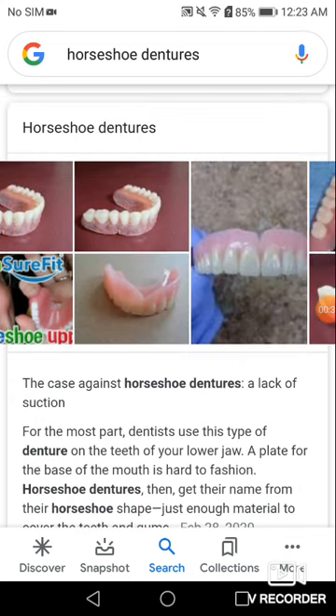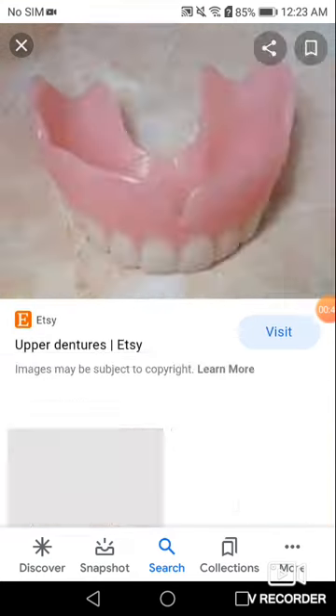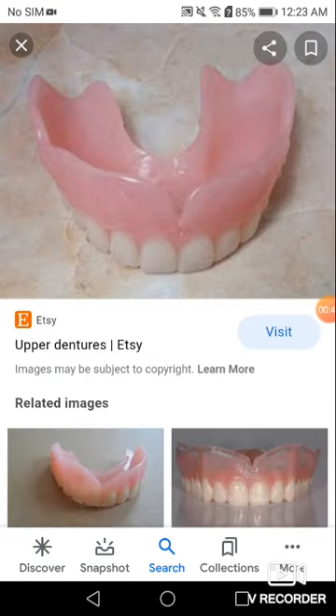I'm going to find some other ones for you guys. Case in point, this one is the top one. See how very little space right in the middle? It doesn't take much off. So can you imagine how much it's going to scrape your tongue and destroy things?